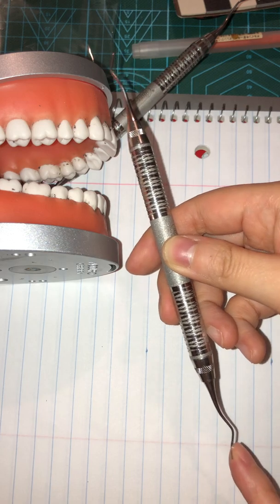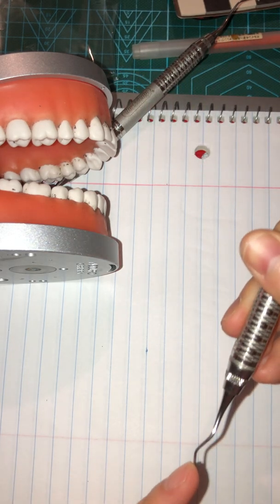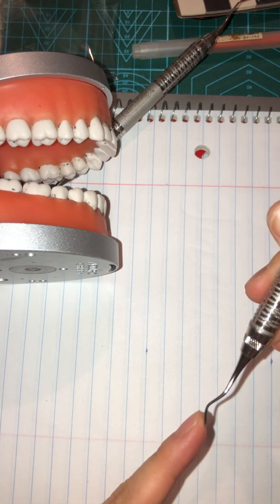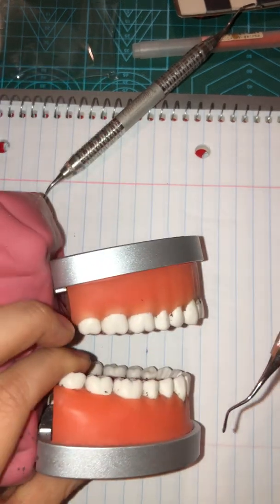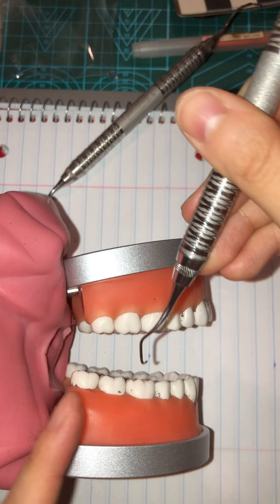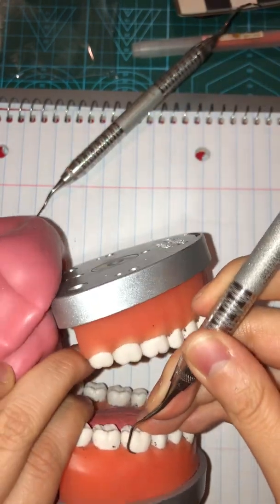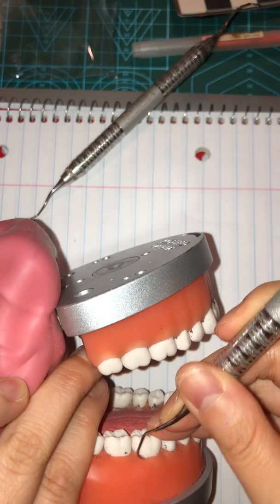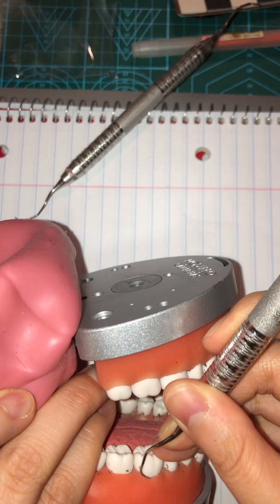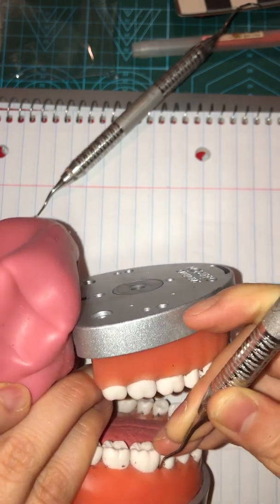So when you flip it around, okay, let's say you're looking at it like this, it's on this side now, right? And now when you put it against the tooth, you know that it is because 15-16 is for mesial surfaces, facial and lingual surfaces. Now when you're scaling it, you would know.